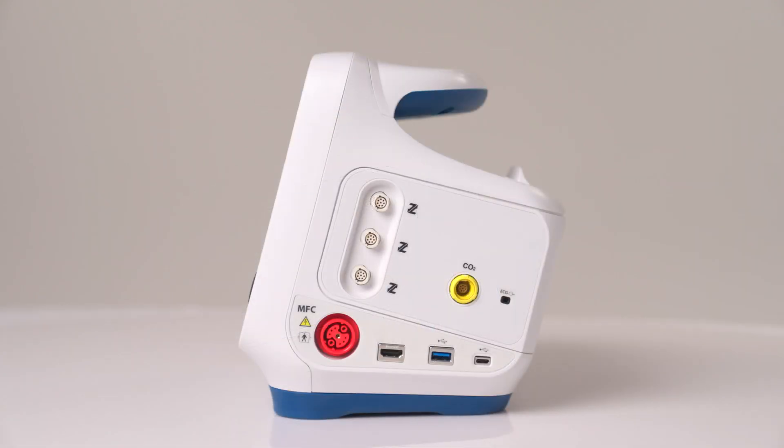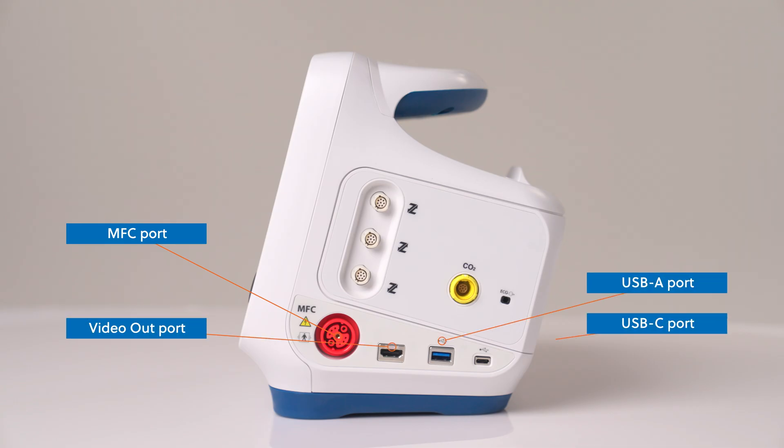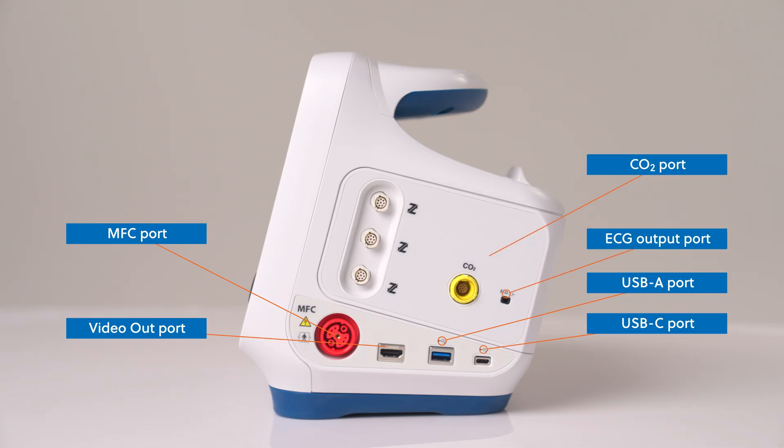On the right side are three additional Z-Link ports that provide proprietary connections for invasive pressure cables, temperature cables, or the AccuVent interface cable. There is also a multi-function cable port. Xenix features a video out port as well as USB-A and C ports, an ECG output port, and a CO2 port.